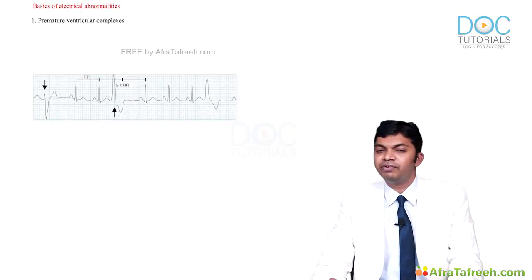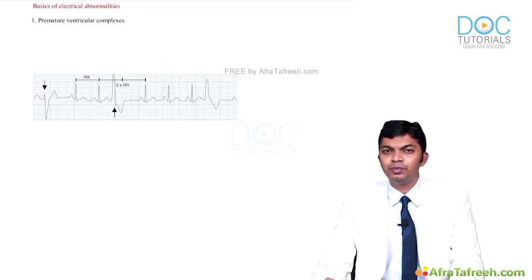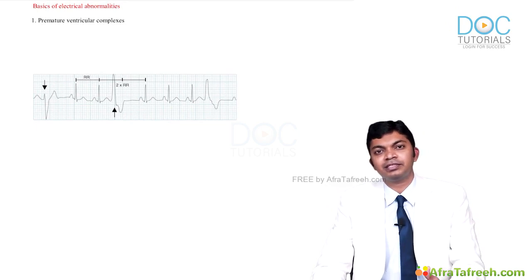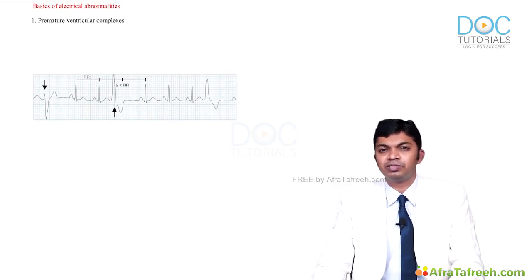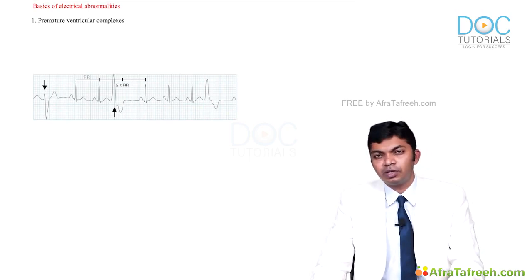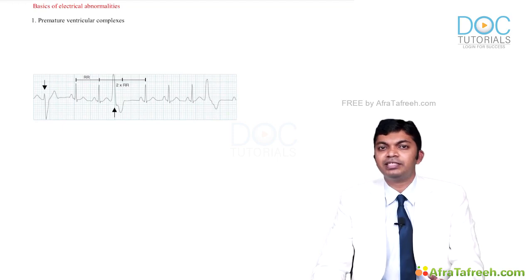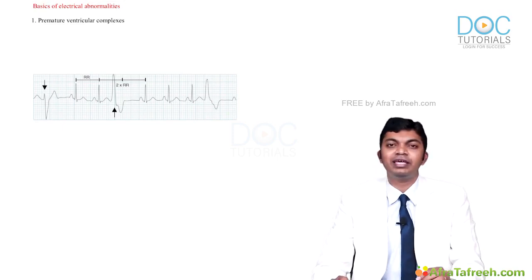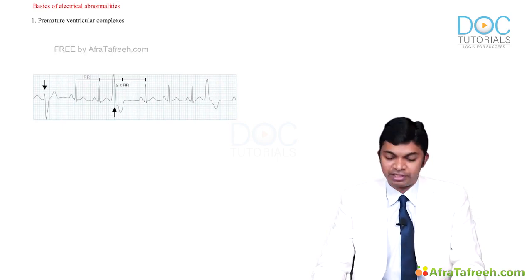In this video, we will be discussing a few key electrical abnormalities of the heart that are represented with ECGs. These disorders have been asked repeatedly in various PG entrance boards across India. So, please pay close attention. These are all very significant ECG changes that we have to pick out very easily from our ECG based questions, doctors.